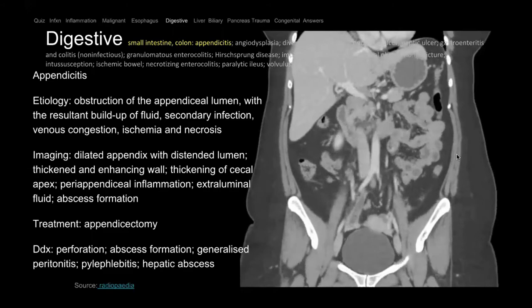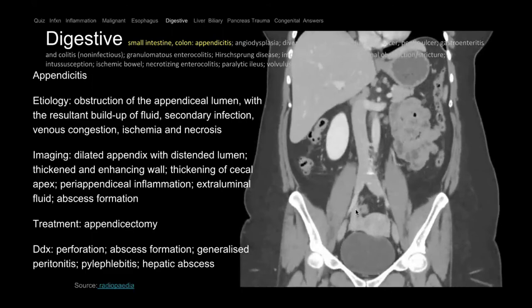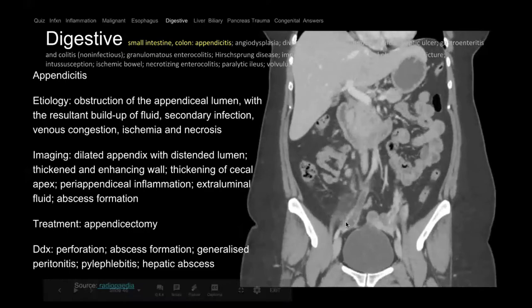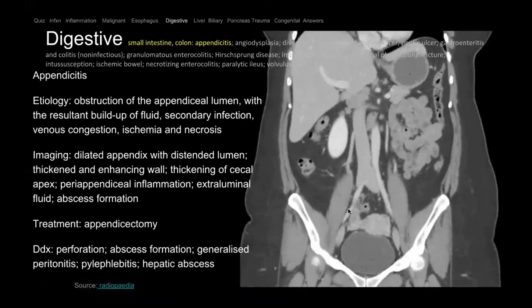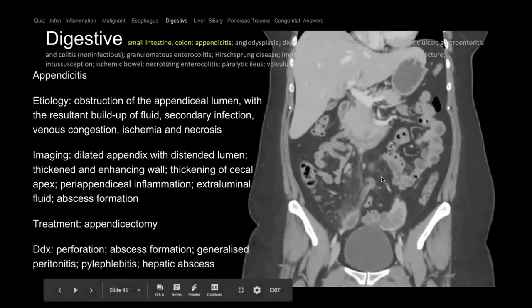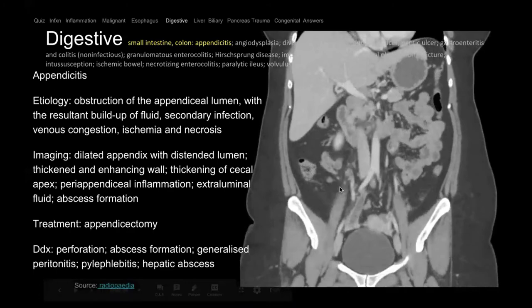Moving on to digestive systems. Here we have a patient with right lower quadrant pain — this is the appendix, a blind-ending tube. There's fluid and appendicoliths — little stones — in it. The fat around the appendix is gray with stranding — fluid intercalating into the fat. This is appendicitis. Appendicitis is treated with surgery, except if it's perforated. A perforated appendix can cause an abscess that needs to be drained by interventional radiology.